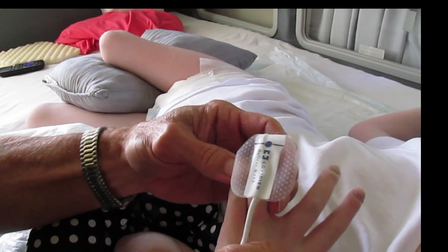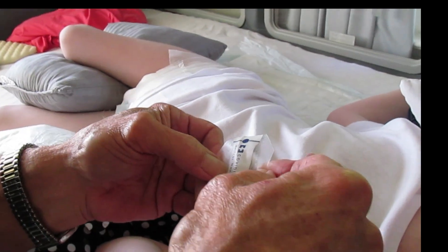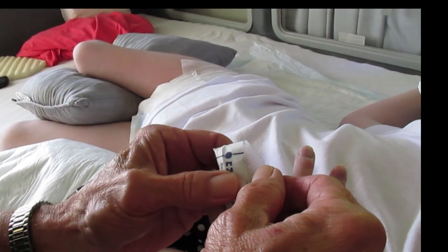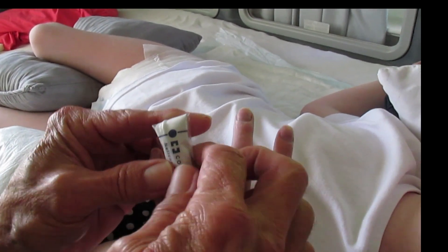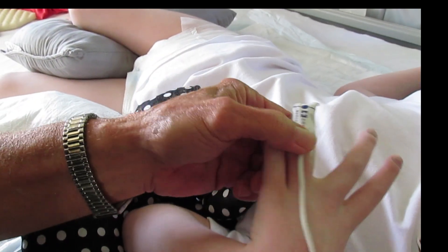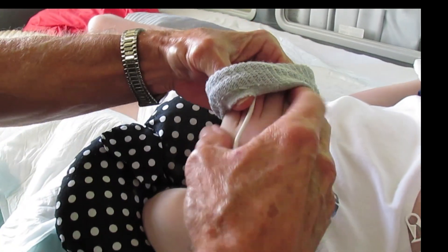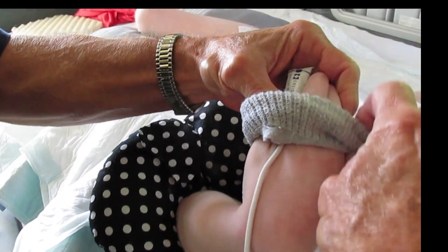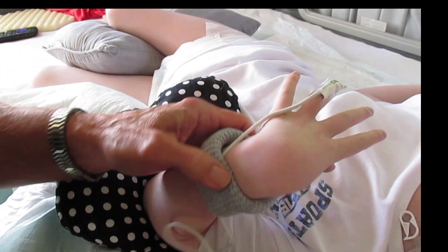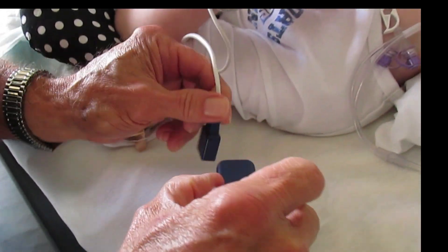We do take these off and reuse them sometimes, which is not recommended because they definitely lose their efficiency after you pull them off — some of the adhesive just comes apart. We try not to reuse them, but when we're running low we have to. Then we use this little sock top to help it stay in place.